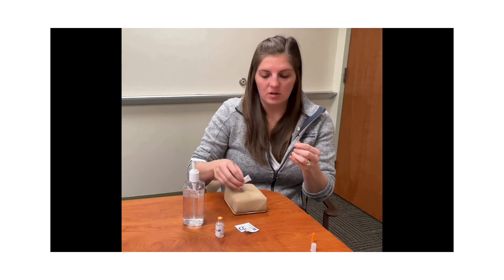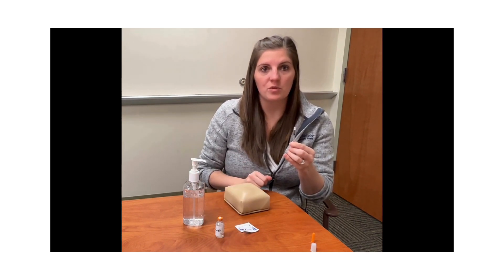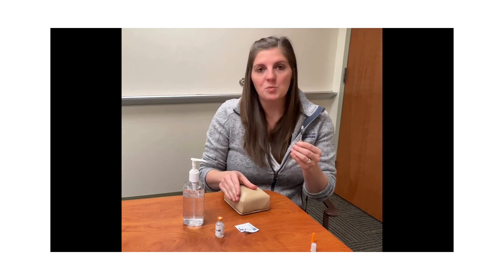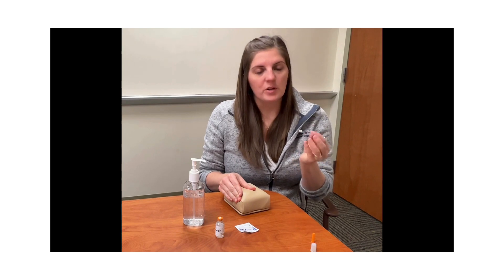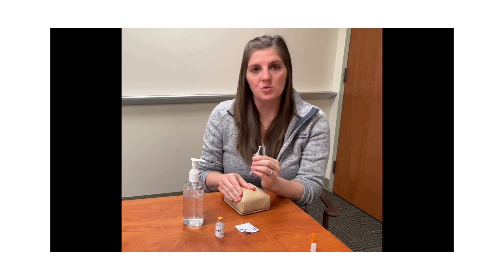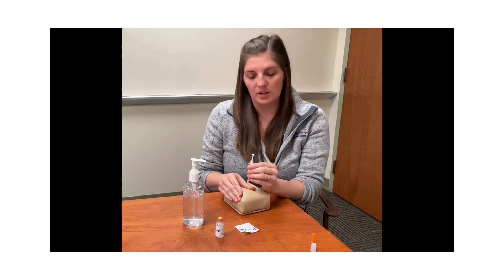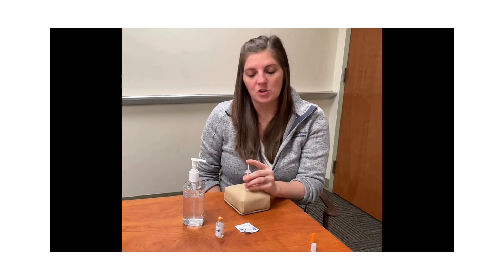You are going to want to take your alcohol and wipe your skin, again making sure that the alcohol on your skin is dry before doing the injection. At this point you can slightly pinch your skin, hold your syringe like a pencil, and insert it with a swift motion at 90 degrees into the skin. Once the needle is in your skin, you can release the hand that is pinching and push the insulin down with the plunger into your skin.